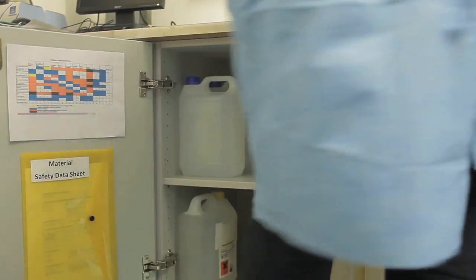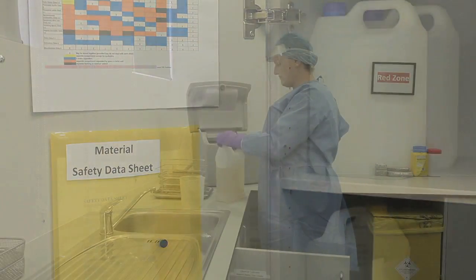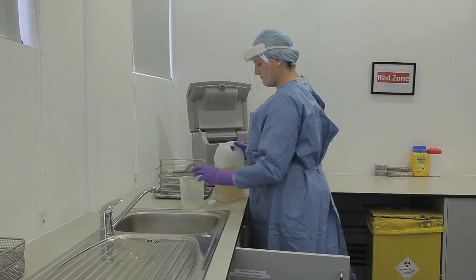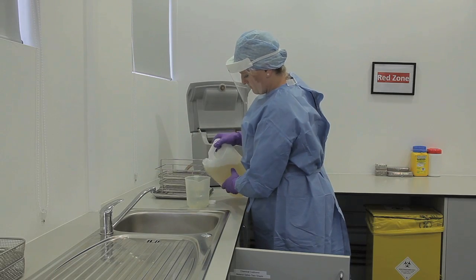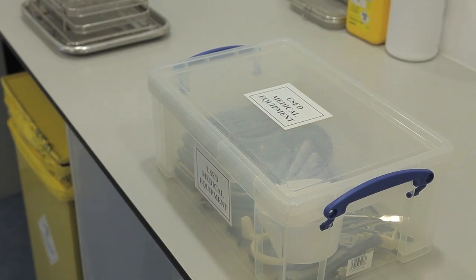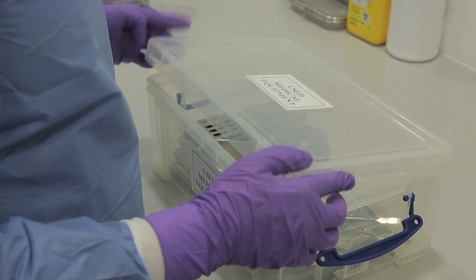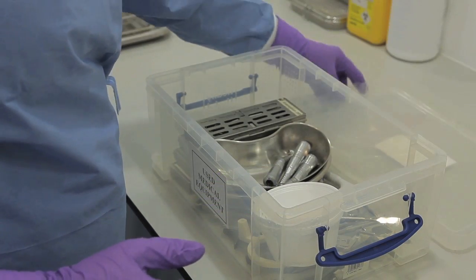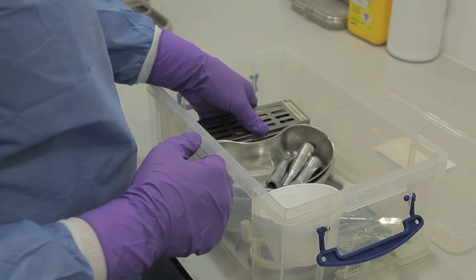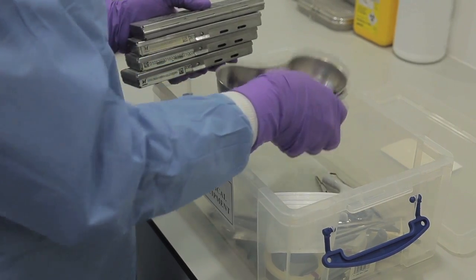This may be tap water or water produced by a reverse osmosis unit. In the LDU, chemicals should be stored in a designated lockable cupboard, which should be clearly labelled. Copies of safety data sheets for all chemical agents used in this area should be readily available. The dental healthcare worker removes kits, kidney dishes and handpieces to the washer disinfector holding area. Burrs and single dental RIMD are placed on the instrument trays ready for the ultrasonic bath.